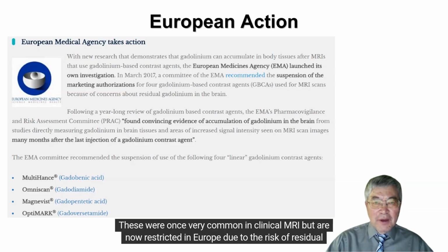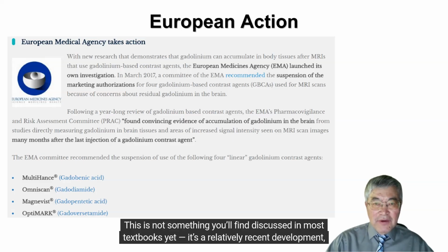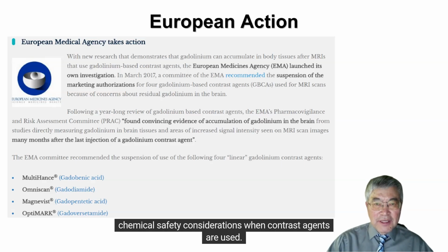These were once very common in clinical MRI but are now restricted in Europe due to the risk of residual gadolinium retention. This is not something you'll find discussed in most textbooks yet. It's a relatively recent development, but an important one to know. It reminds us that while MRI is a non-ionizing and generally safe imaging technique, it still comes with chemical safety considerations when contrast agents are used.